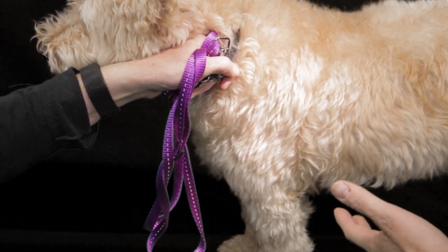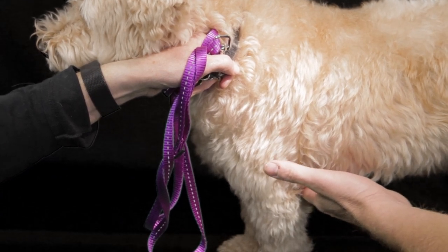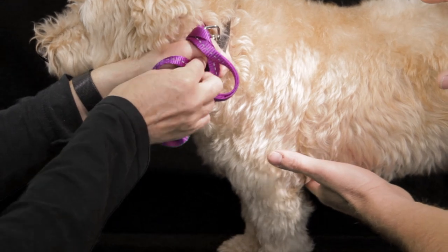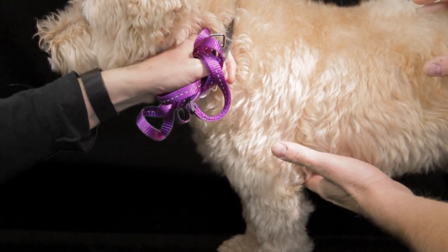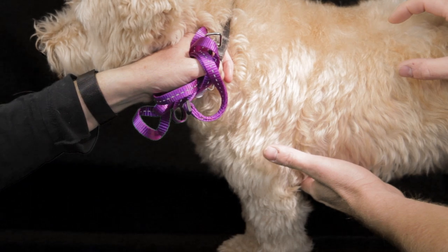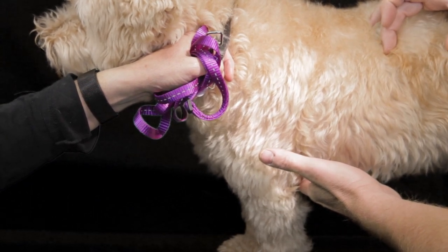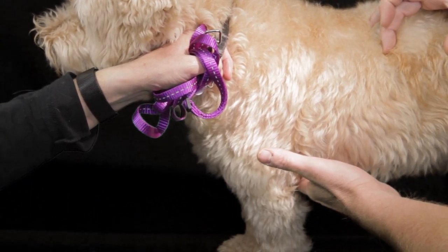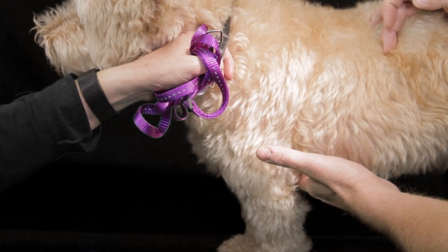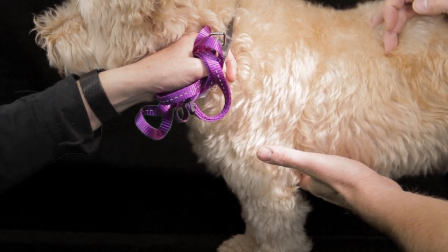There are a couple of different ways lung ultrasound can be done as reported in the veterinary literature. We can do a regional lung scan, which has been termed the Vet BLUE scan. This is essentially looking at four different regions of the lung on each side of the chest. We're going to look at a caudal dorsal area, look for a glide sign, and look for interstitial alveolar pathology represented by B-lines.